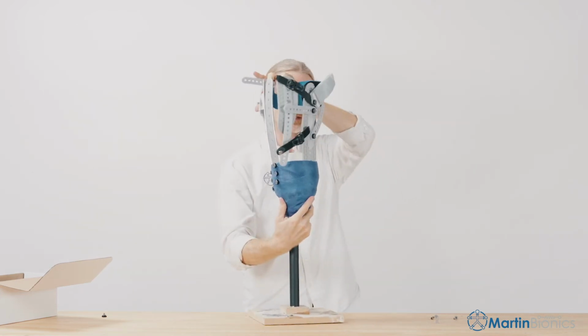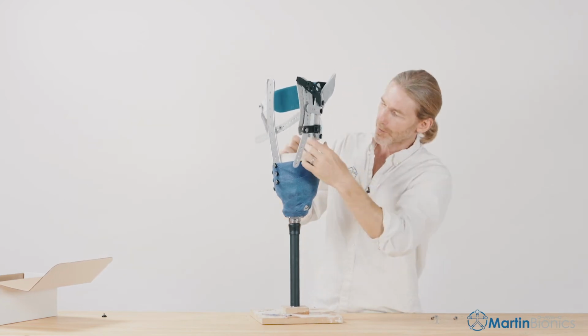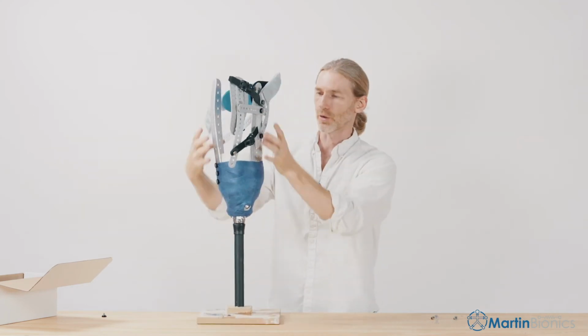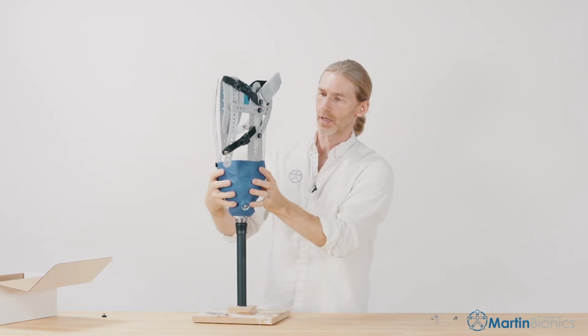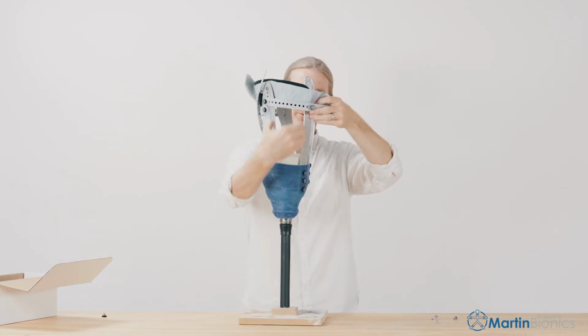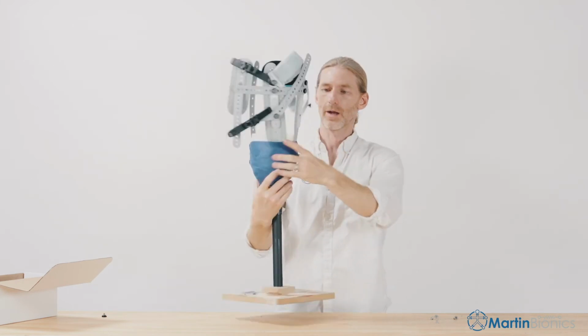Swing it back around, anterior perspective. Bring this one around a little bit further. That looks better to me. So all of these 4 struts should be pretty symmetrical around the limb. And medial, there's a medial perspective, posterior perspective. Again, we're framing that hamstring muscle belly due posterior. All right, that's about right where we want them.